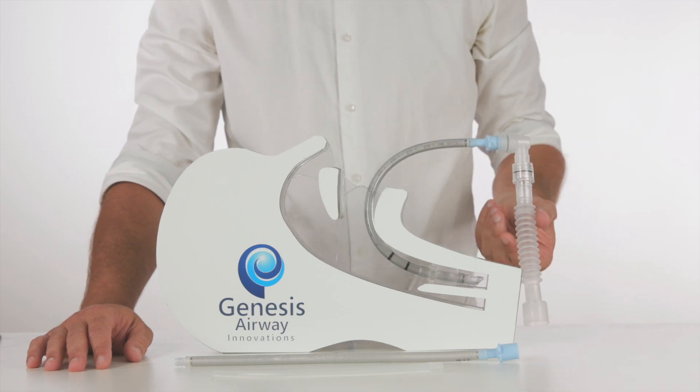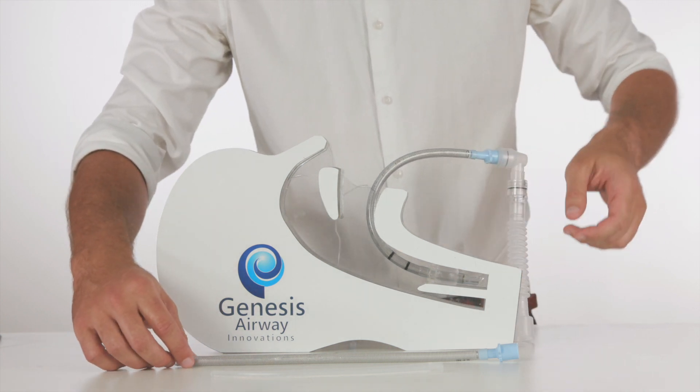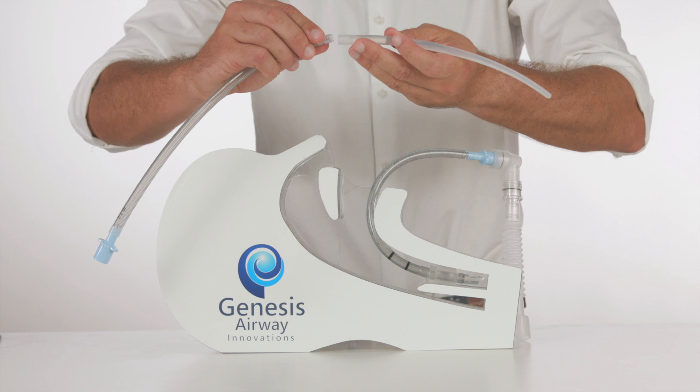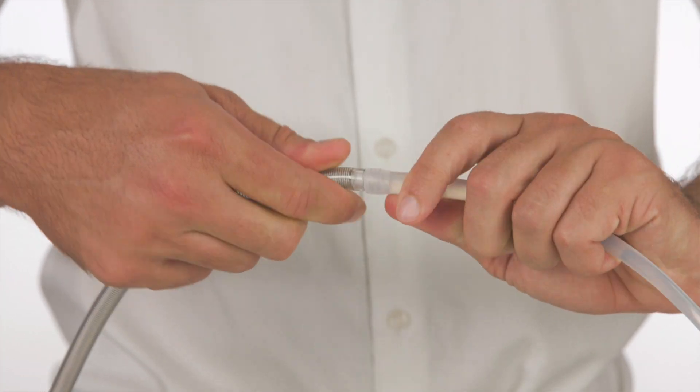We begin with the patient being ventilated with a size 7 Genesis Airway ETT. The flexible reinforced airway tubing is connected to the introducer with a twisting motion.